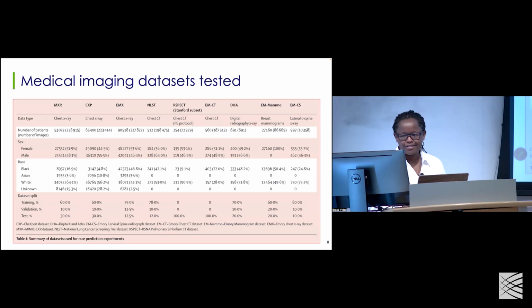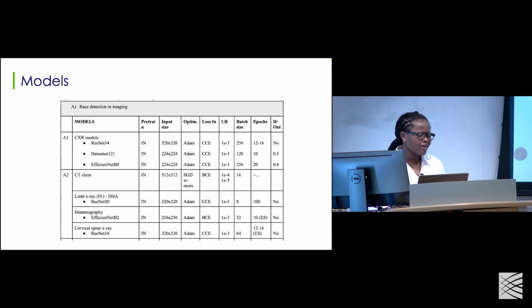So we started off with chest X-rays, and then we started hypothesizing, why is this? I will show some of those results. They're really published. It's just a recap so that we're all starting off from the same page and move on to other modalities. And there was never really anything novel, and there has never still been anything novel in terms of the deep learning approaches that we're using. But what we did at this point was to just test more than one architecture. But these findings always start, if you show the training curve, around the third epoch you're already in the 90s percentile. So there wasn't anything that we were trying to fine tune.